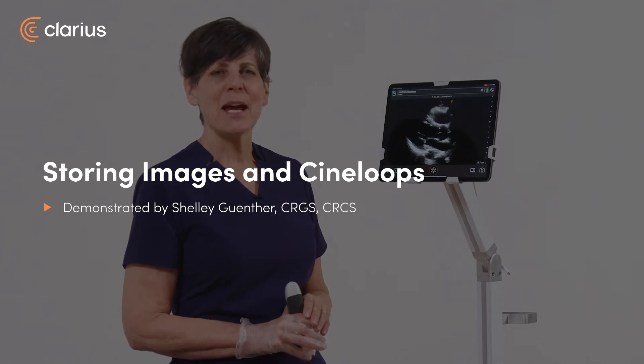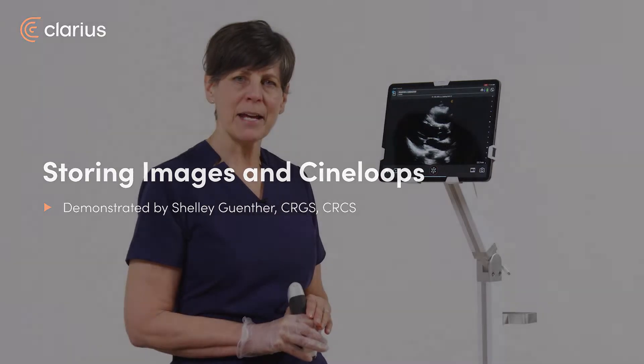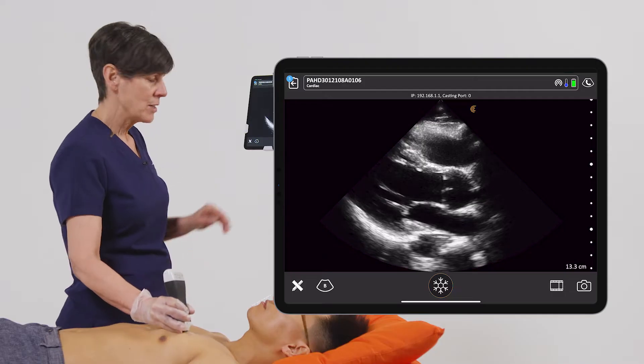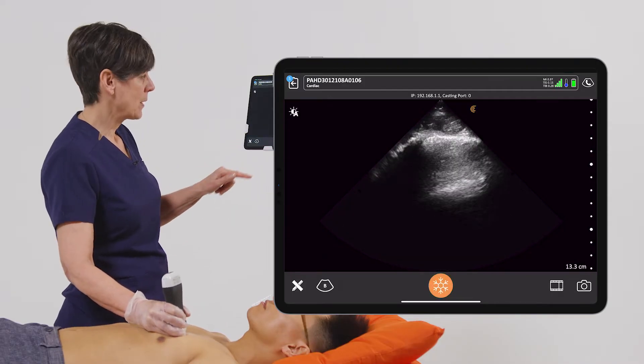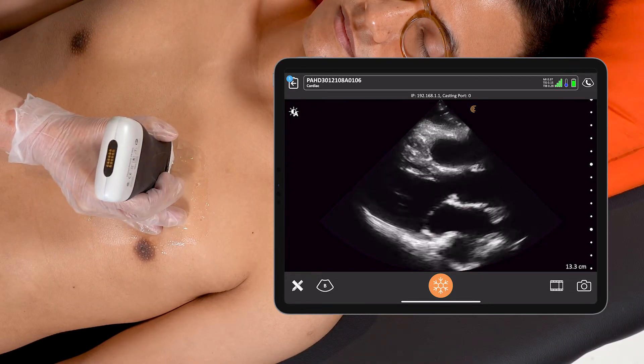Hi, my name is Shelley and today I'm going to show you how you can store images as well as cine clips with your Clarius scanner. In this patient I'm doing a cardiac exam — it's a dynamic exam, so I'm going to want both still images for measurements as well as cine loops.